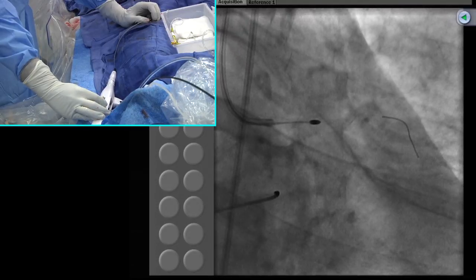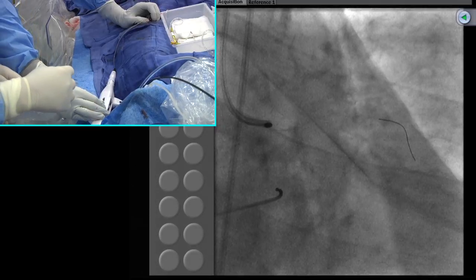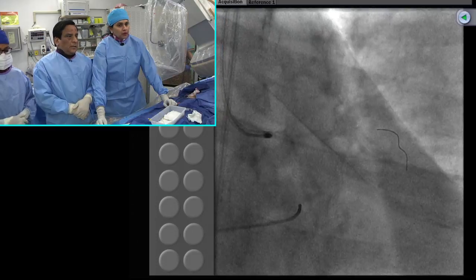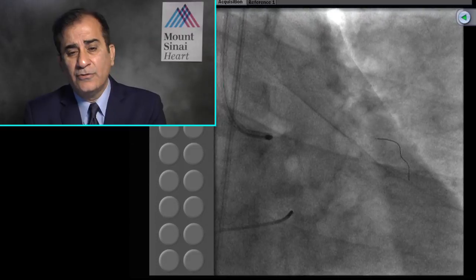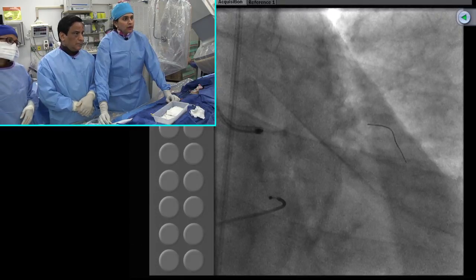Went through very nicely. Good. Do one more polish? Yeah. Okay. Anu, you are planning to burr down the circ also, no? We will see if the wire goes easy right now. Okay. We will do that.